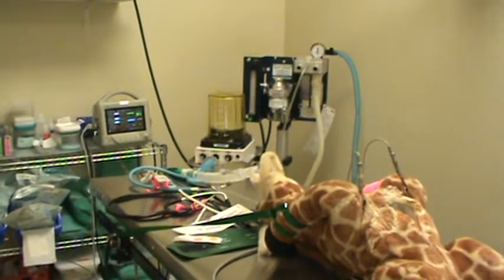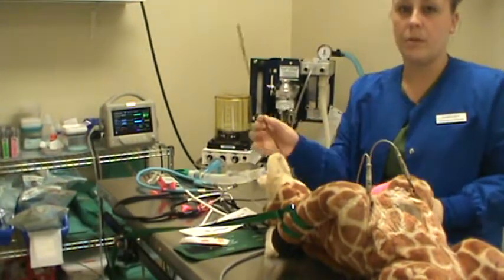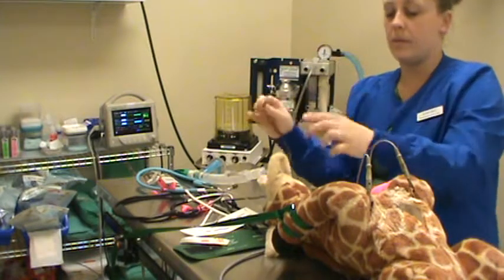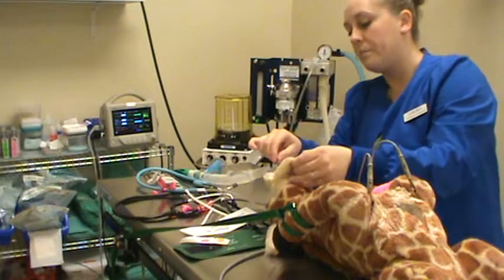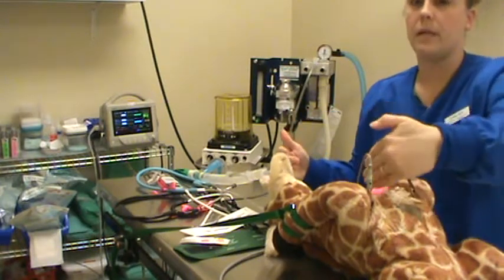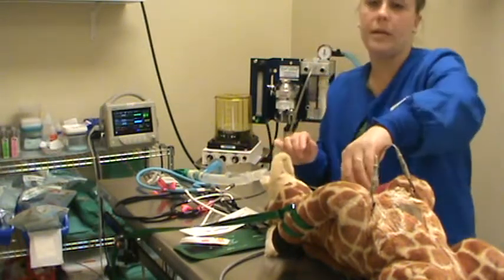Okay, so we're back at our patient here who is hooked up to the ECG with the leads. Second thing I'm going to put in here is our temperature probe. We have an oral temperature probe here. Some clinics might use a rectal probe, but this is oral. We lubricate that with a little bit of sterile lube, and it goes down, sits right next to the ET tube, but it actually goes down the esophagus. It's going to go down to about here on the patient, and lay right next to the heart, so you get a really good consistent reading of the temperature of the body.